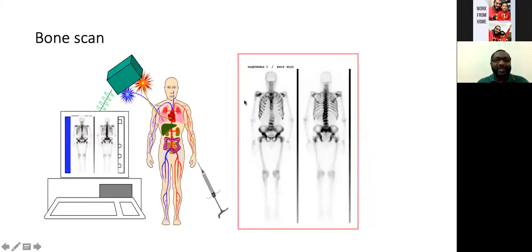So again, this table just gives you a pictorial presentation of what we do in terms of nuclear medicine acquisition in most nuclear medicine departments. So this injection is what we give to our patients. In this circumstance, we inject the patient with technetium labeled with MDP. And then the patient becomes a source of radiation. So radiation comes out from the patient, and our scintigraphic camera, in this case our SPECT camera, will then detect it, and there are numerous processes that happen before the image is displayed as an anterior and posterior projection. So this is basically what the imaging principle of nuclear medicine entails.